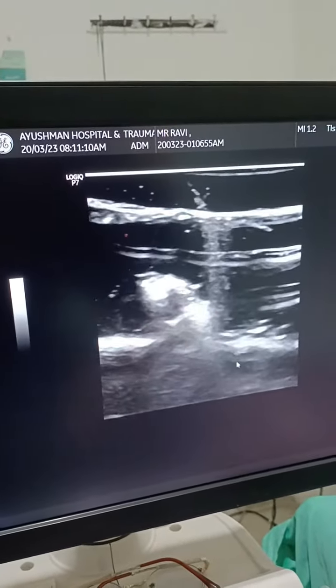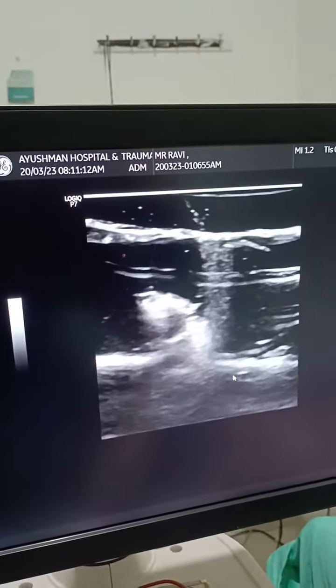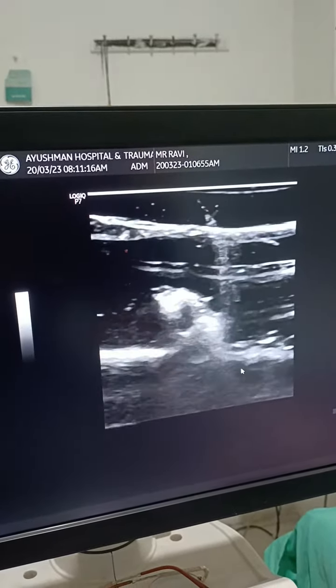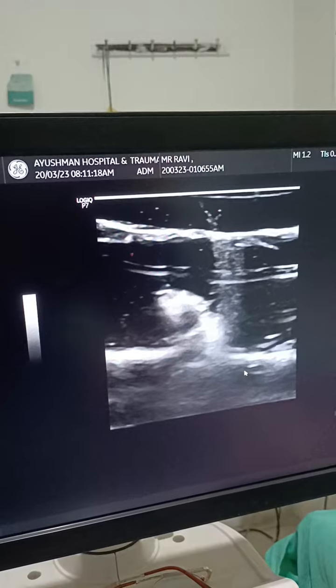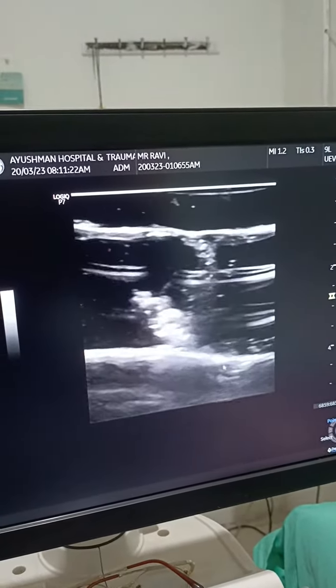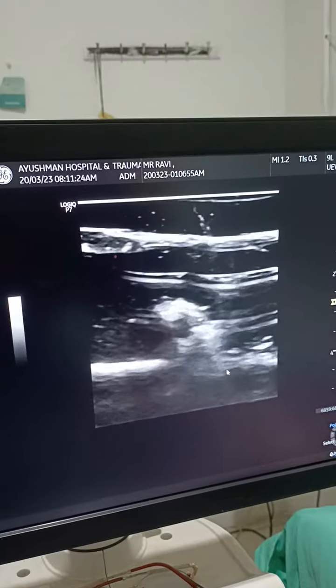Hello, today I am demonstrating the Verv Brachial Plexus Block Trainer. First of all, you will have to invoke a fictional contact between the instructor and the candidate, so that they are tuned to simulation learning.